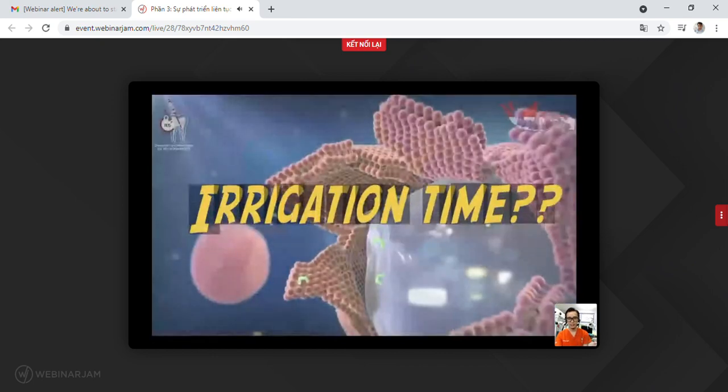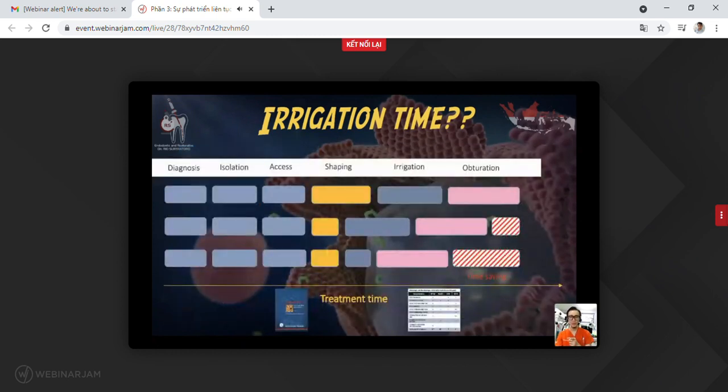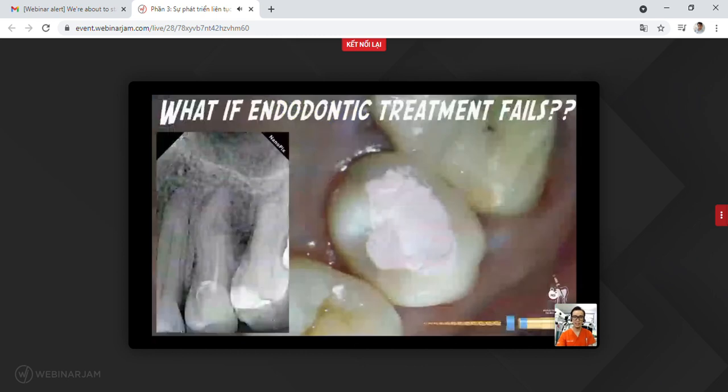And you may ask me, what is the proper irrigation time? From the American Association of Endodontists, the minimum irrigation time, if you are using sodium hypochlorite, is 40 minutes. So if you want to do single visit endo, please do at least 40 minutes as a minimum irrigation time. And if you are using activation, you will reduce the irrigation time because activation will increase the effectiveness of the irrigating solution. Thus, we need lower irrigation time, and it is time saving for you. You can do endo in less than 20 minutes in a single canal.